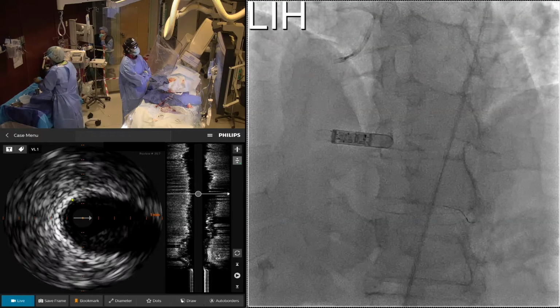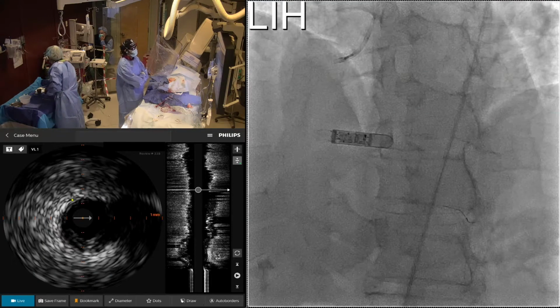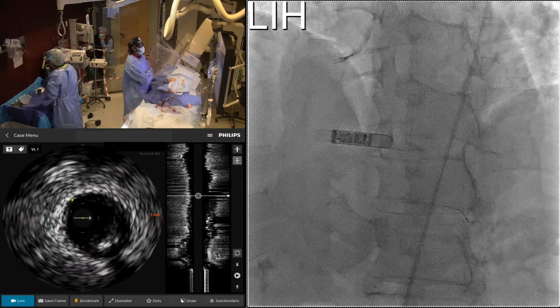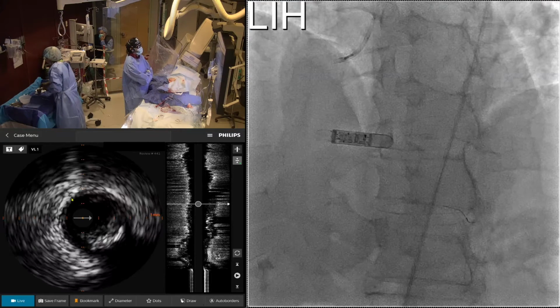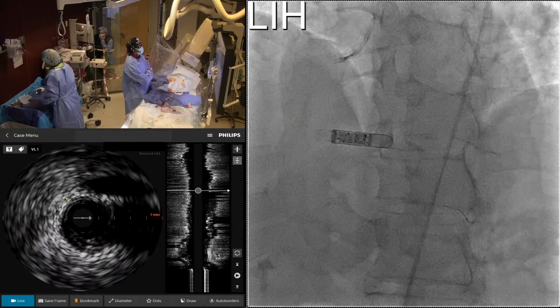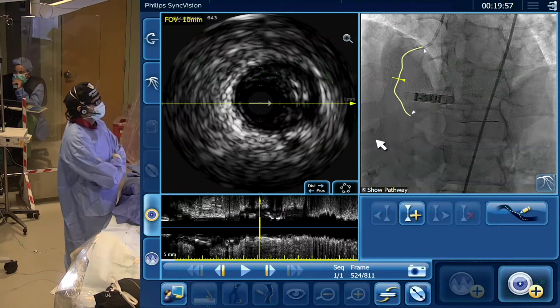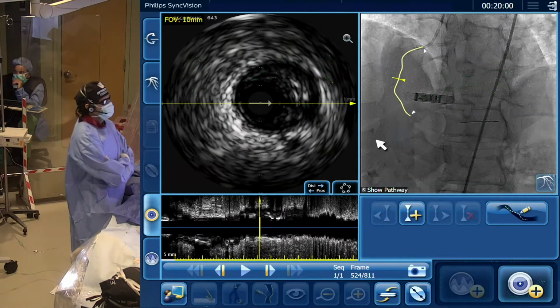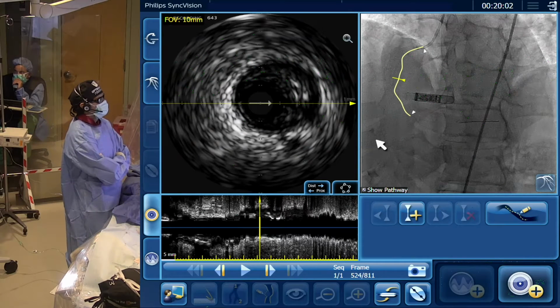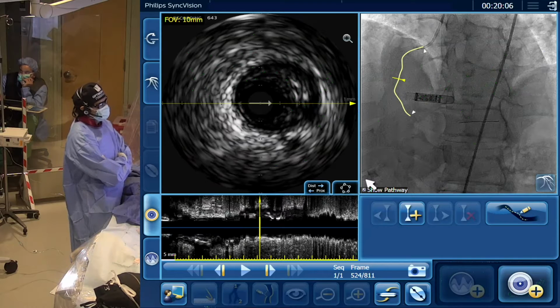So I think we need to stent across the branch. Look, there is disease distal to the branch. So we have no option. I would say the landing zone should be somewhere just distal to the branch. How about here? That's perfect. Something like this. So let's co-register this. It's a 3.5 vessel down here. Good. All right.